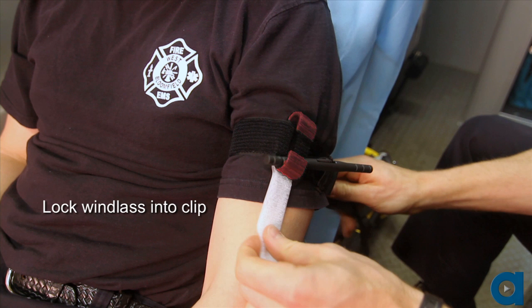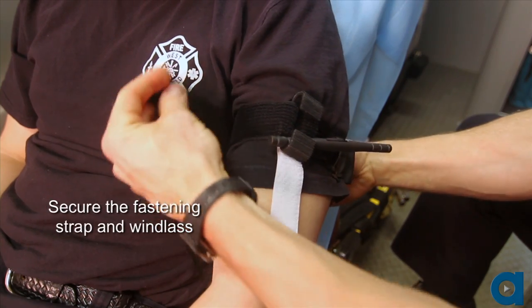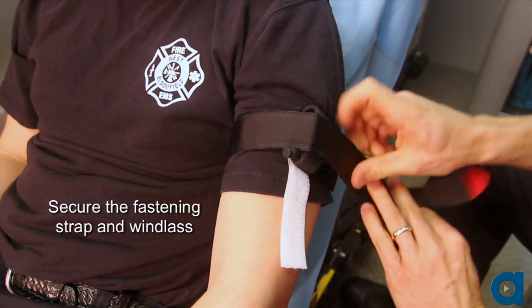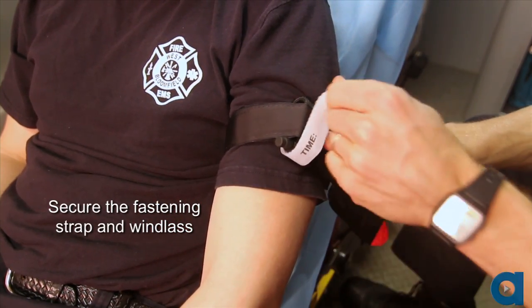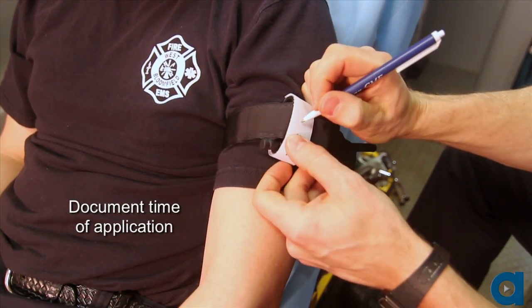Feed the remaining length of the securing strap through the windlass clip. Secure the fastening strap and the windlass in the windlass clip using the windlass strap. Document the time the tourniquet was applied on the windlass strap.